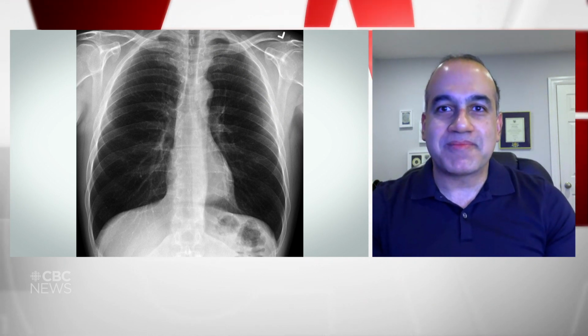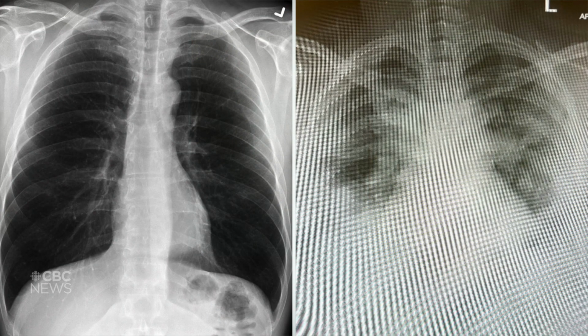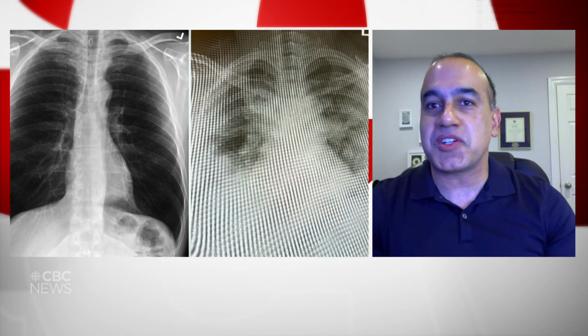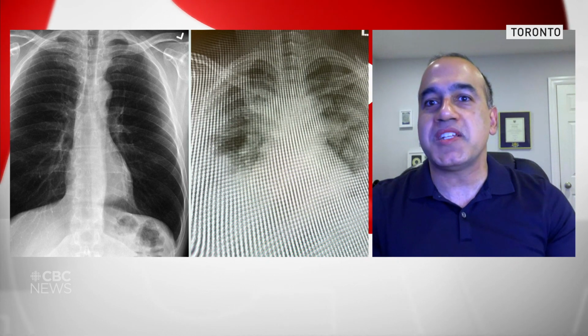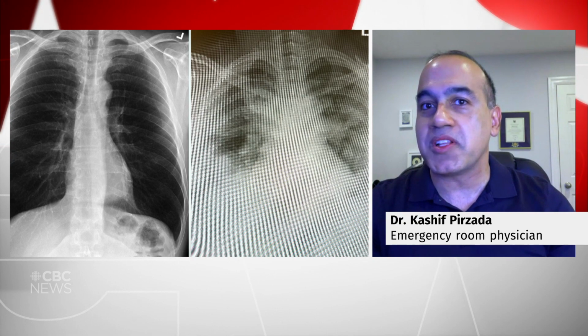Okay, we have a series of 3 side-by-sides. I'm going to bring one up first of all. This is a 35-year-old patient. Tell me what you see there. So you can see that there's the heart in the middle, and then around there's big splotches of white. So that's lung with fluid in it. This is basically pneumonia, viral pneumonia from COVID. And this person basically is almost drowning in fluid, and they're not exchanging gas, and their oxygen levels are very low. And this person was only in their mid-30s, but if I had to look at this X-ray and I didn't know their age, this looks like an X-ray of someone much older, in their 70s or 80s.